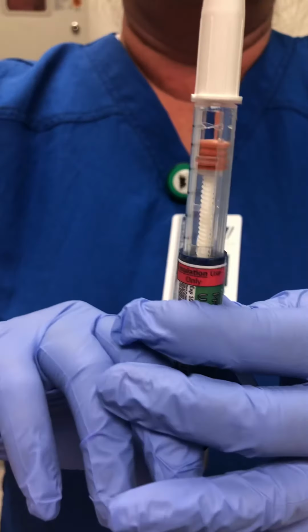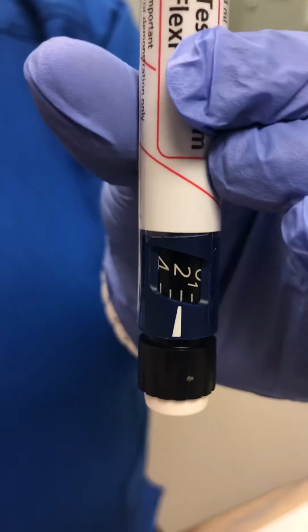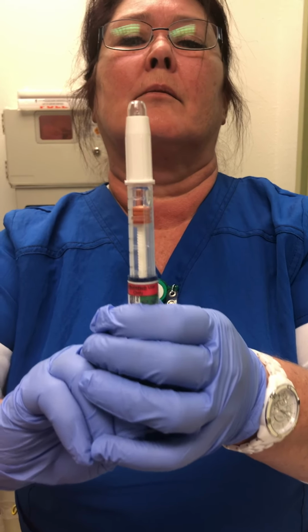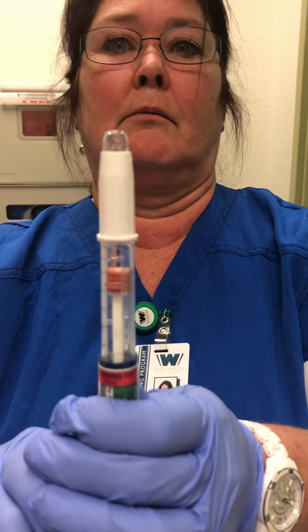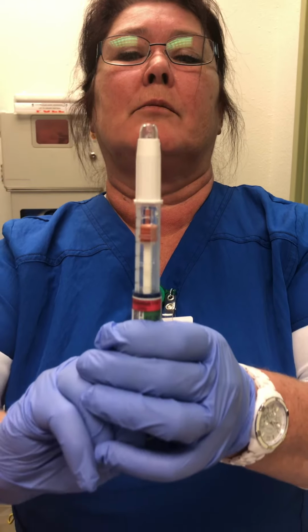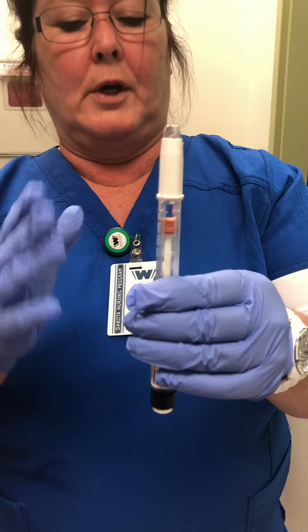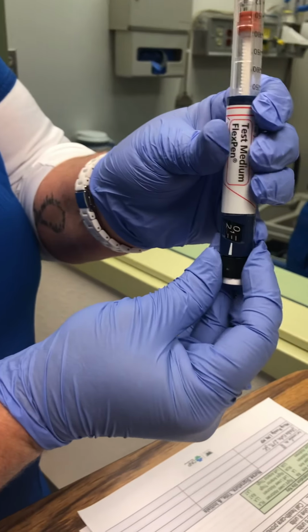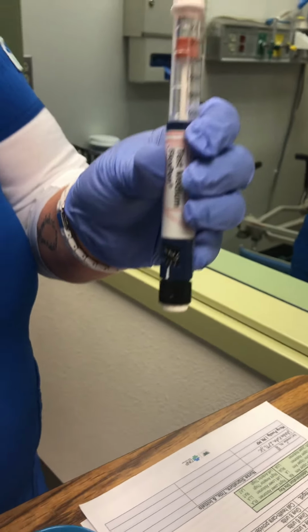Let me see your dial. Perfect. And now we're going to prime. See it shoot out? Okay. So since we got it primed, I'm now going to dial up to 2. Perfect.